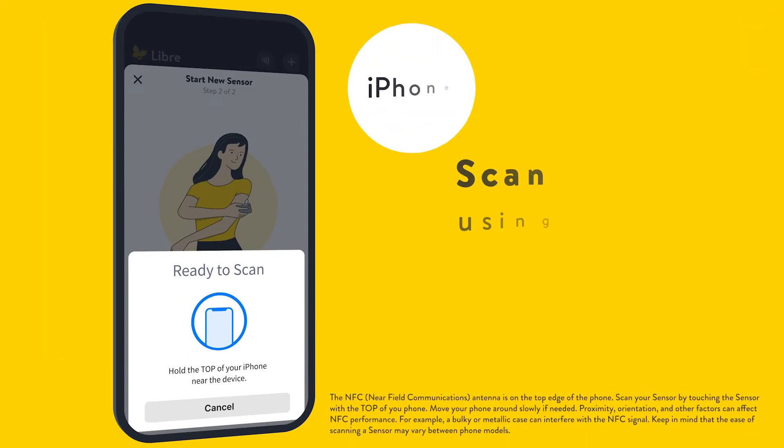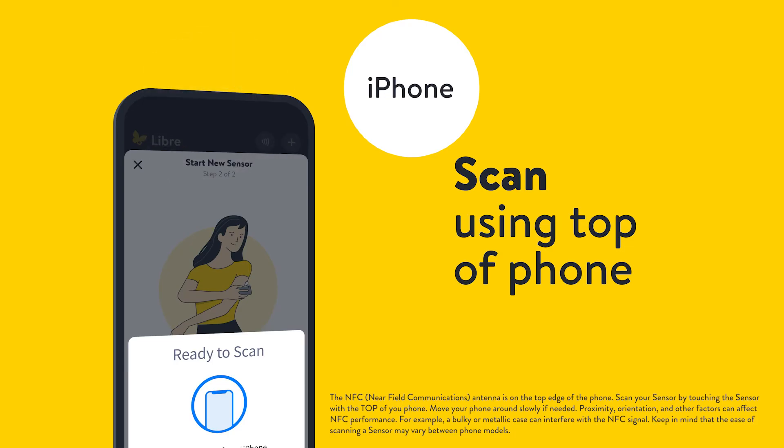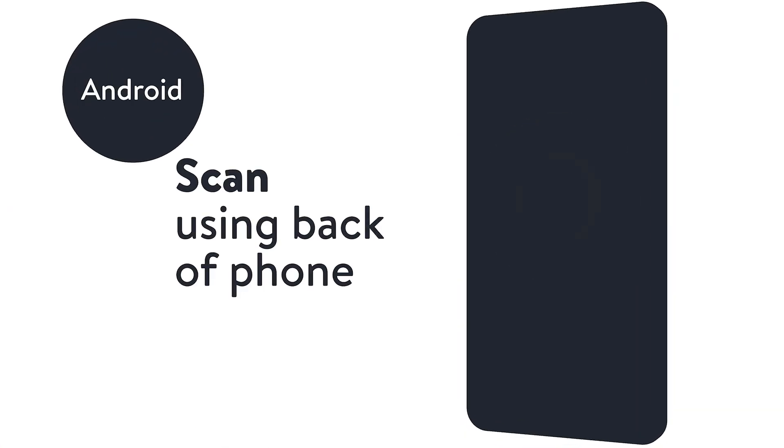If you have an iPhone, scan using the top of your phone. For Android, scan using the back of your phone.